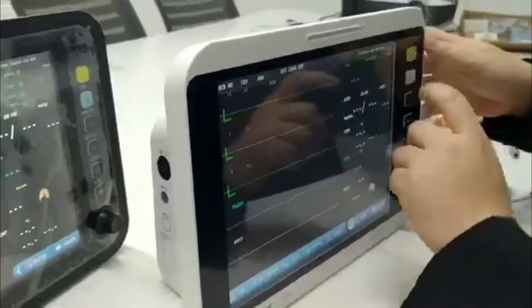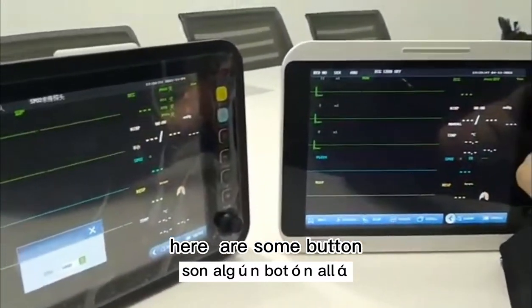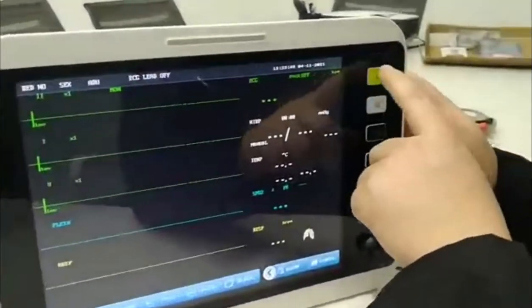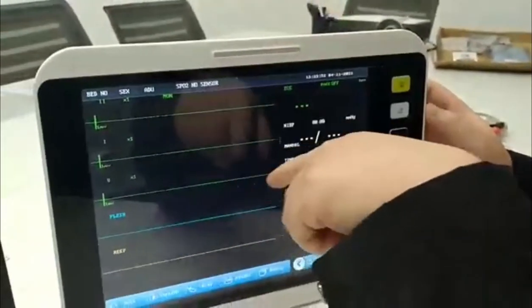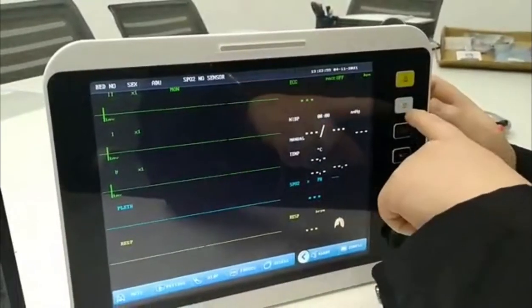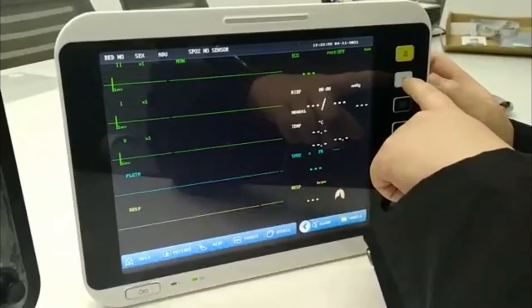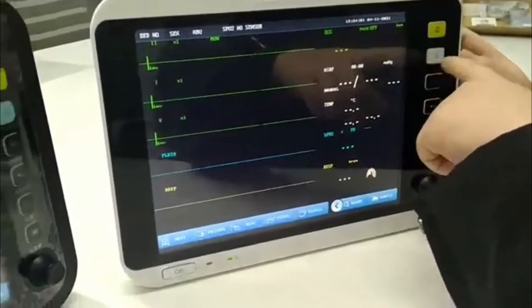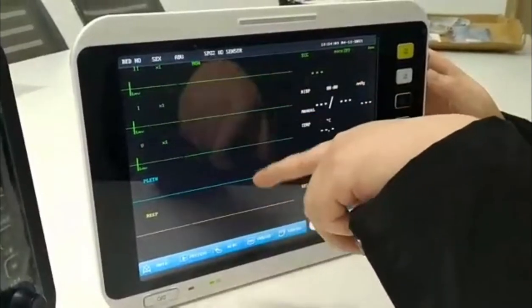This display is 12-inch. Here, there are some buttons. The first one is silence, normally used for machine sound. The second one is for alarm stop. The third one is for freeze, for waveforms.